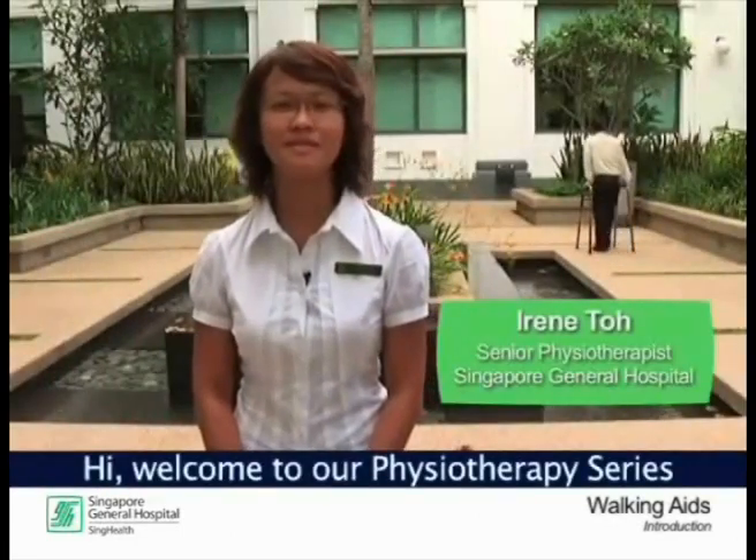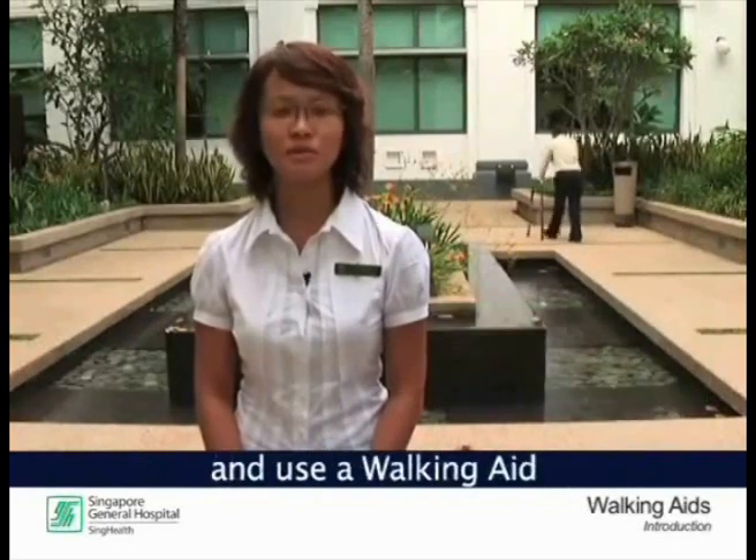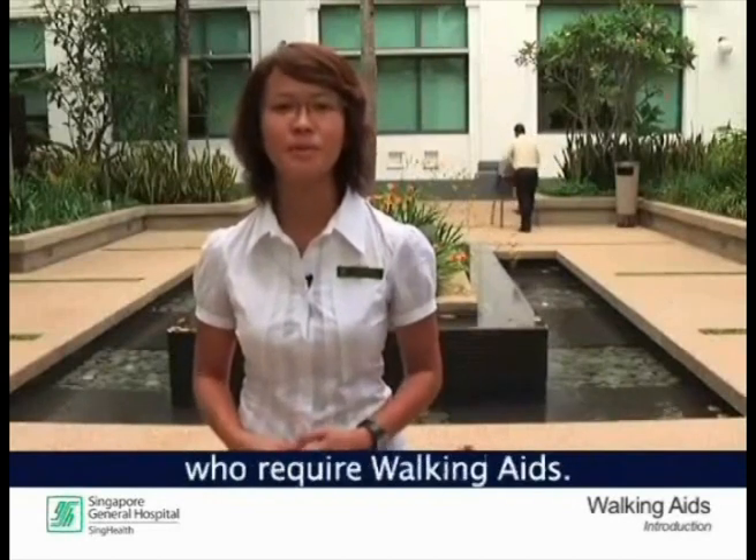Hi, welcome to our physiotherapy series on walking aids. Today we will be showing you how to select and use a walking aid that best caters to your needs, or that of a loved one who requires walking aids.